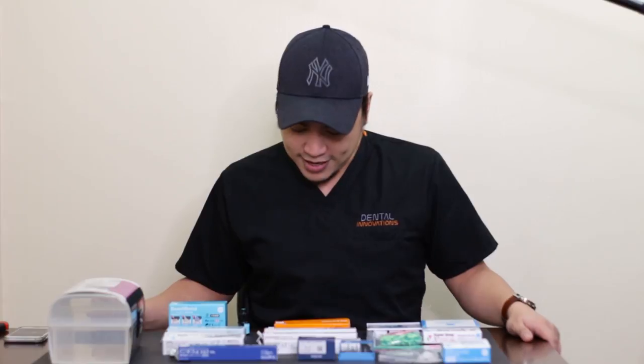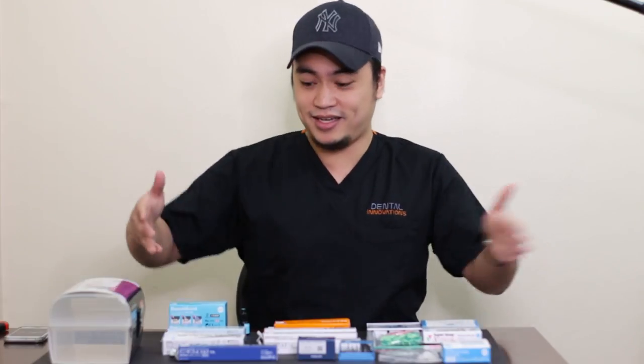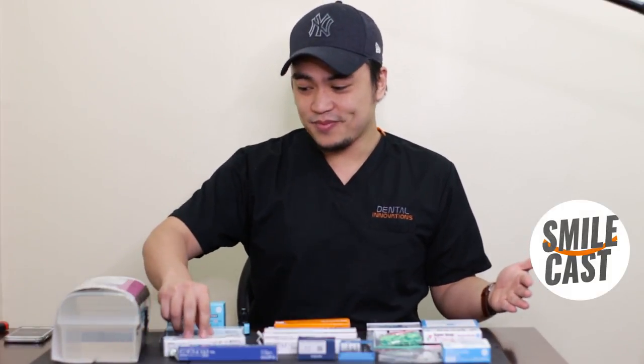The polishing kit is very, very extensive. They put a lot of pink and green kits, and if you know, the pink and green discs are for the final polishing. I am excited to use all of this. All of that came from this little box. There's definitely no way I can put it back in — I'll have to figure that out later. But this Smart Restorative Kit is wonderful.